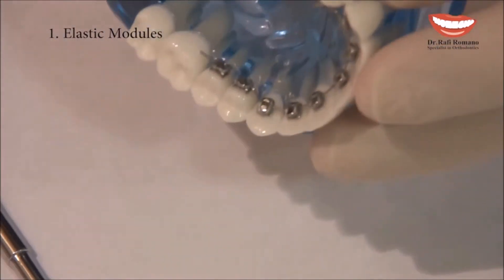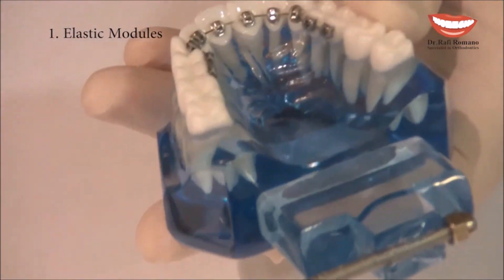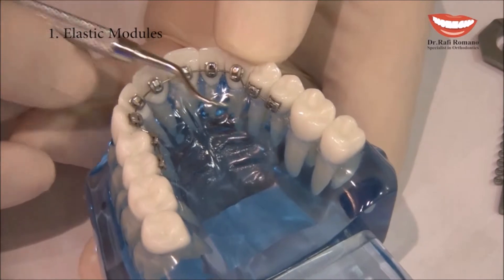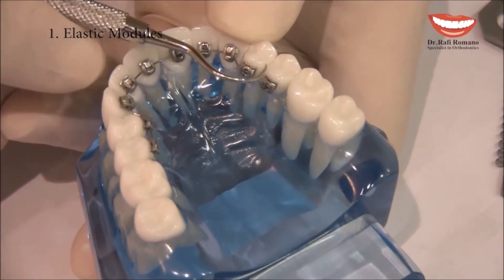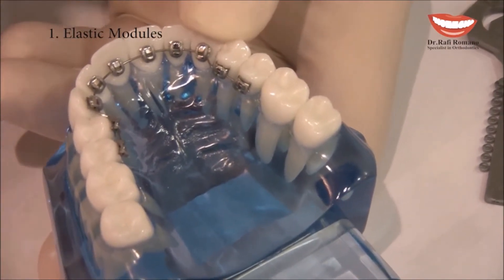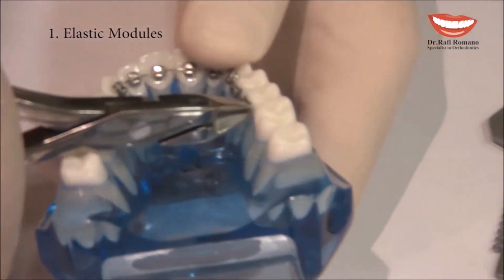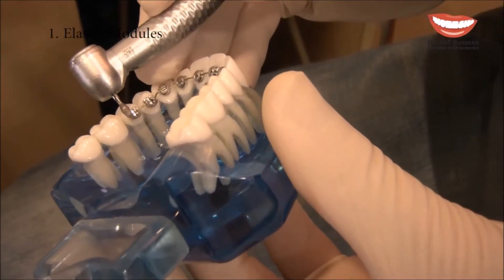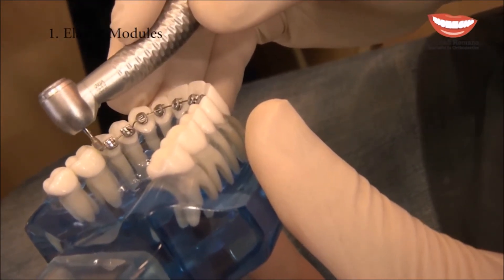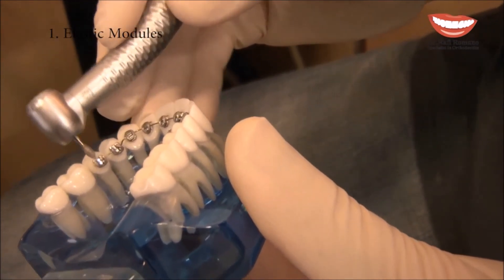I can use the distal cutter, but as you will see, even when you get close to the bracket, after cutting there is still a little wire extending distally to the terminal bracket. This wire will definitely poke the patient's tongue. We can either use a regular ligature cutter, or I can use a diamond bur — usually a flame shape — and then slowly and gently cut the excess wire. If needed, replace the elastic module because sometimes it gets torn by the bur.